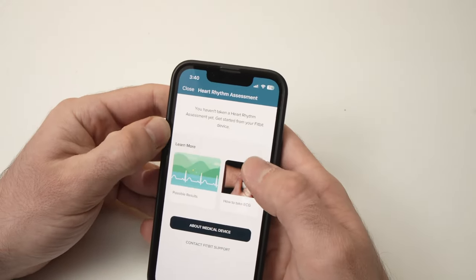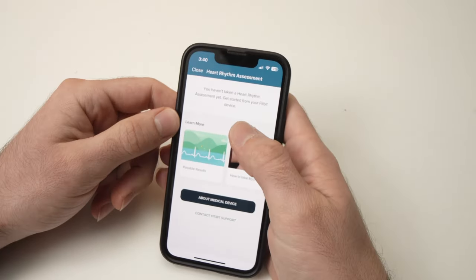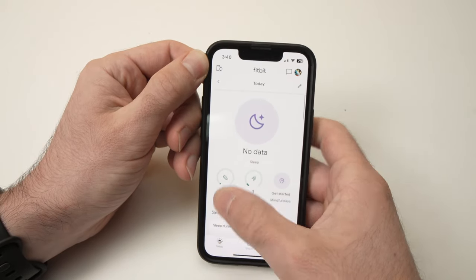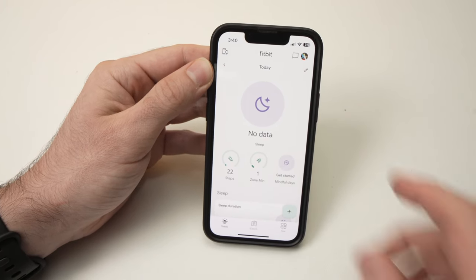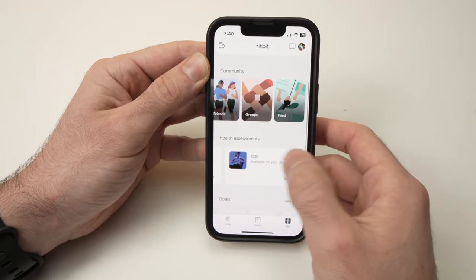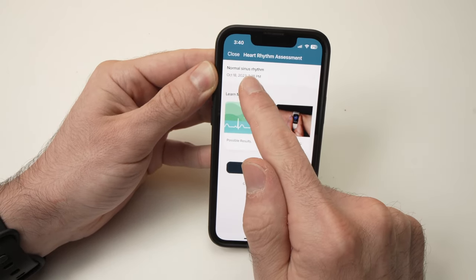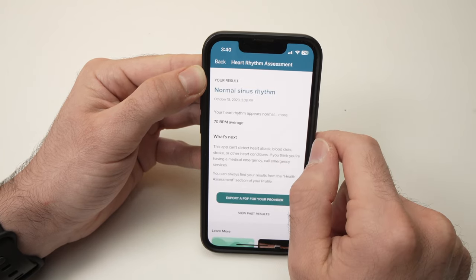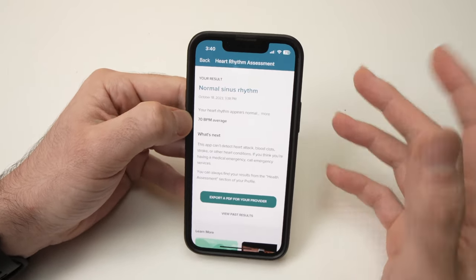Now let's check the result in the app. The watch isn't synced yet so there's nothing showing. To sync your Fitbit, close this screen, go to Today, and slide down — the Fitbit will sync with the app. Once synced, go back to 'You', then scroll down to ECG, and at the top you'll see the result: Normal Sinus Rhythm. Press on it to view details and export.